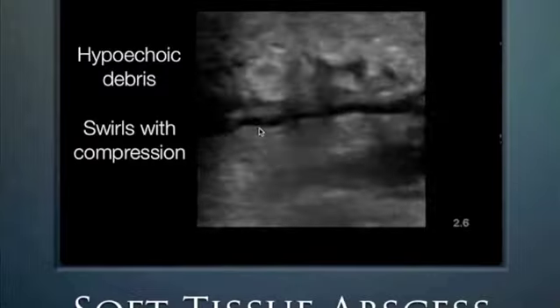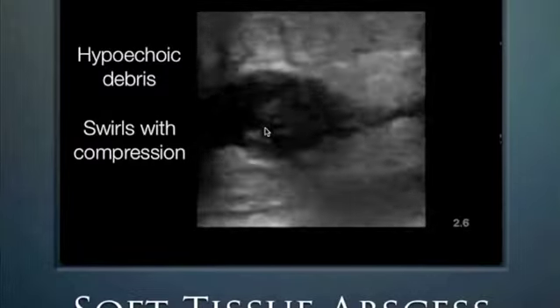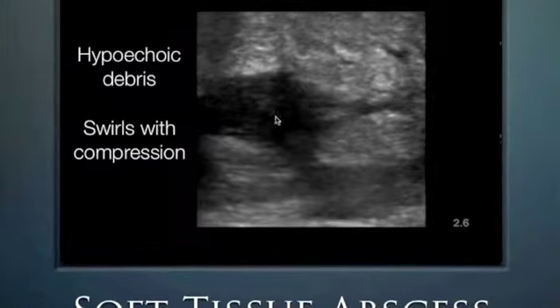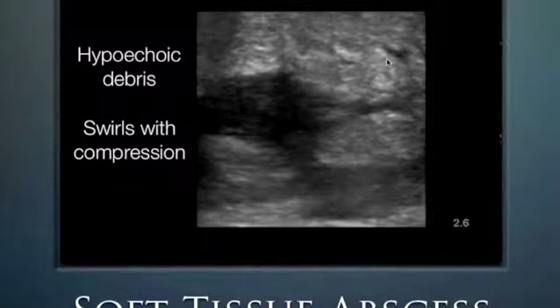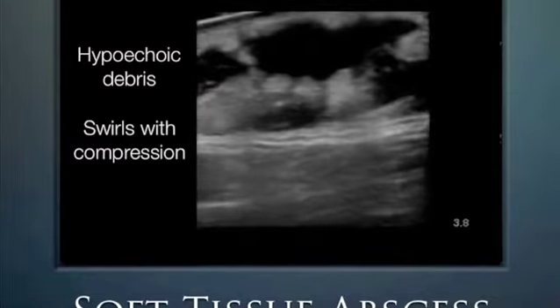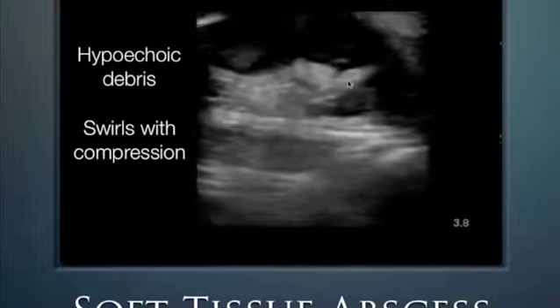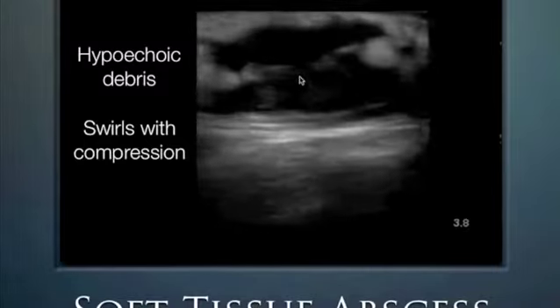Just another example of what an abscess looks like: hypoechoic debris, sometimes with a little cobblestoning of cellulitis in between abscess areas. This is all what pus looks like under ultrasound. The patient clearly has a very prominent abscess, with some inflamed hypoechoic tissue consistent with overlying cellulitis.